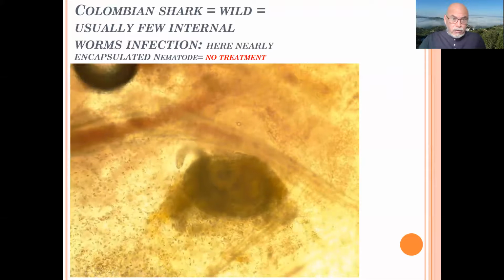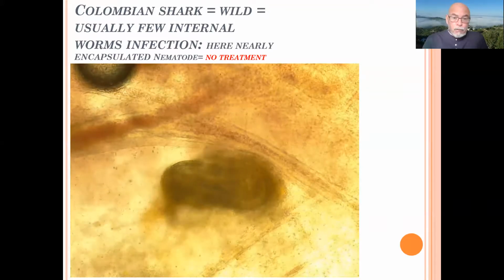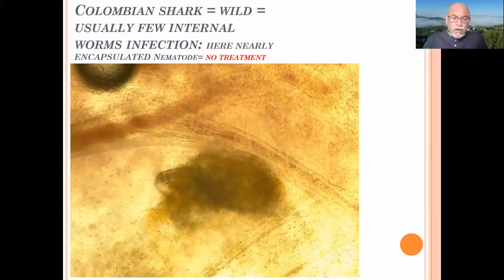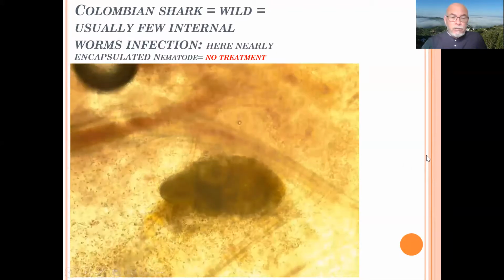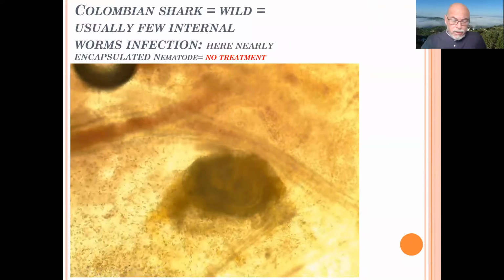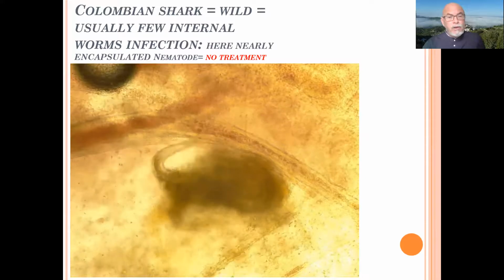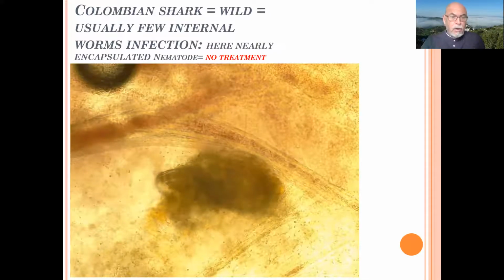Also, checking this Colombian shark, which is a wild fish from Colombia, we find quite often worms. And here you see a nematode, which is nearly encapsulated. The encapsulation process is done by the fish. It's a defense system of the fish that when he is healthy enough, he encapsulates the worm, and the nematode will become less effective and less risk of spreading diseases to other fish. So when it's encapsulated, no treatment is possible.